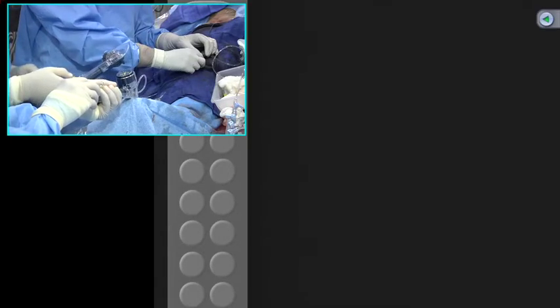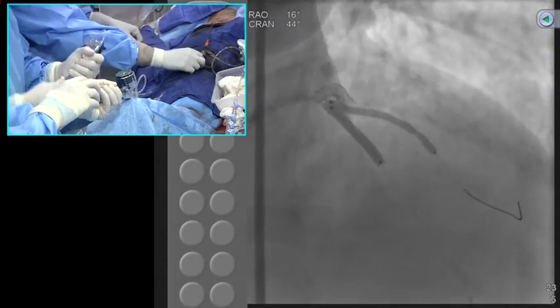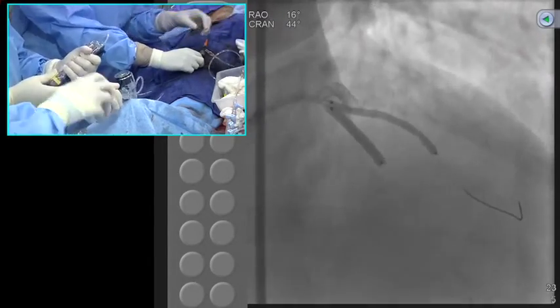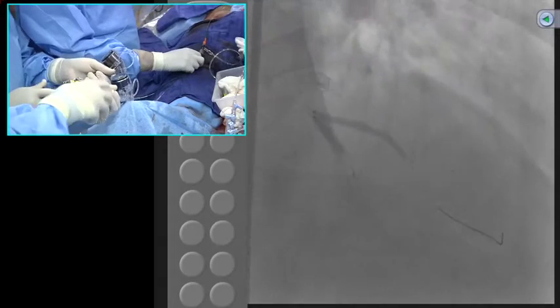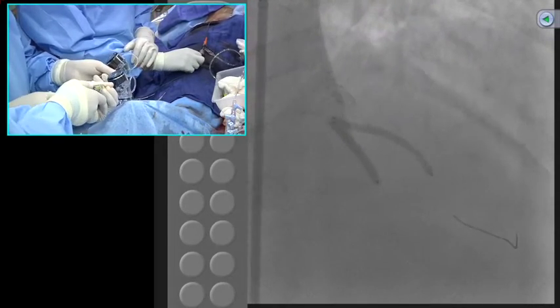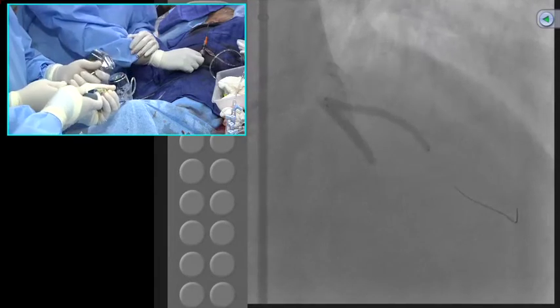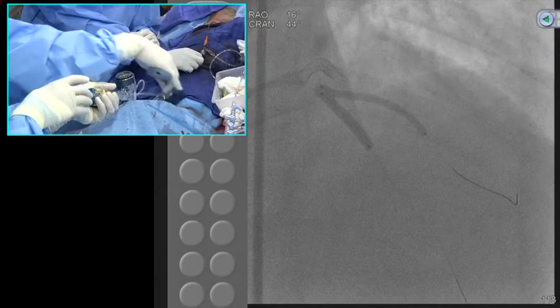So this is a V-stent, about a millimeter of carina only. See, the two dots are close. We didn't pre-dilate the distal part, that's why. I need to post-dilate there. Yeah, we can. Okay. Don't go higher. One by one, right? Yeah. So it didn't go one by one.